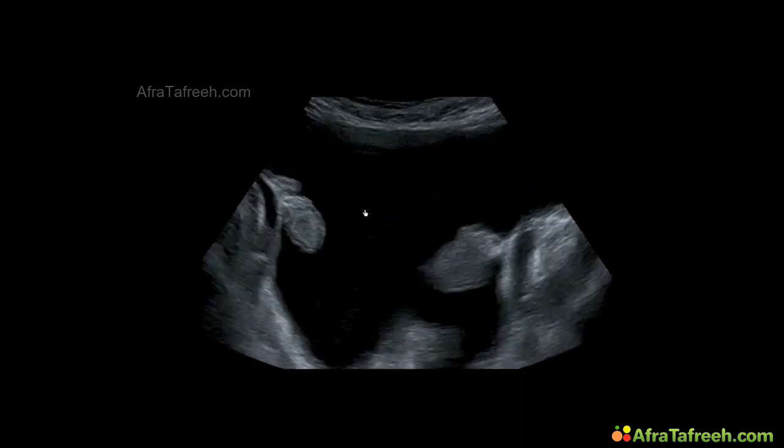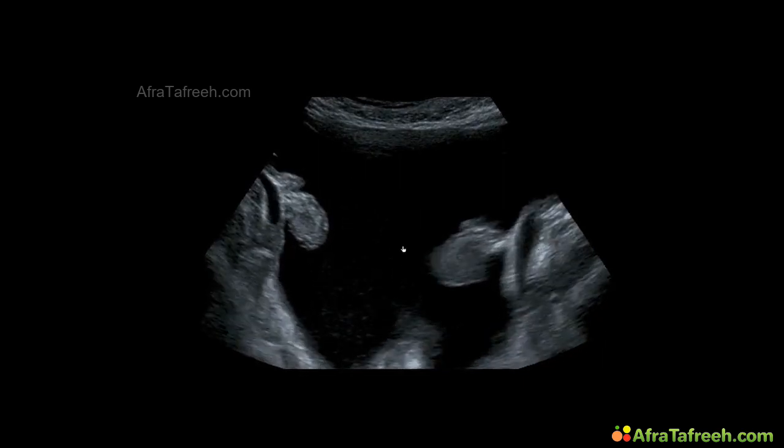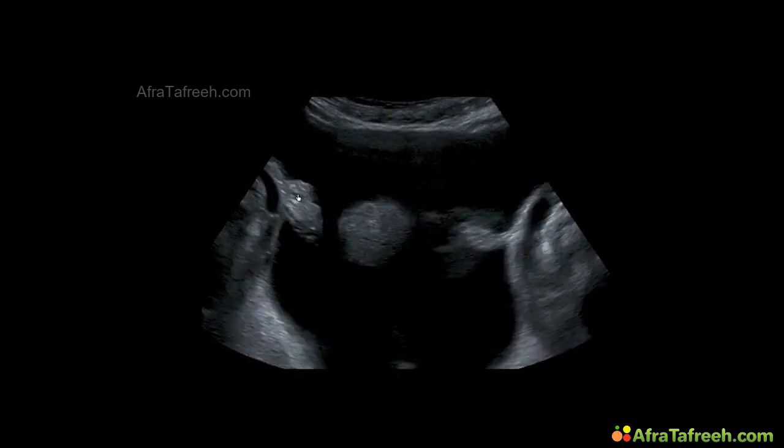When we scan the uterus, we can easily detect the ovaries on the right and on the left side, and also the ligamenta connecting the uterus with the lower abdomen.